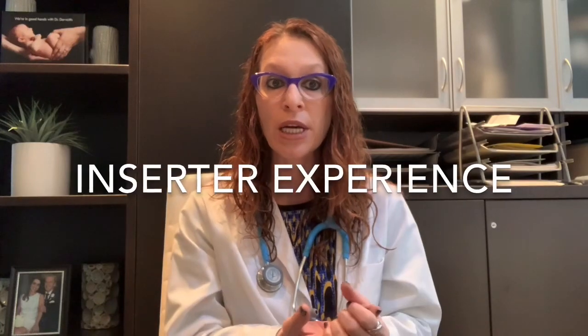Another situation that's quoted in the literature in terms of risk factors is potentially an inserter who might be less experienced at IUD insertions. So like all things and all procedures, the more procedures one does, the more skill that person might have, and that can certainly factor into the equation. But I want to mention that even in the hands of the most experienced inserter, there is still this potential risk of uterine perforation. It's a risk that cannot be completely eliminated. So those are some of the situations where we might see a uterine perforation, although as I mentioned, in some situations there might not actually be an identifiable risk factor.